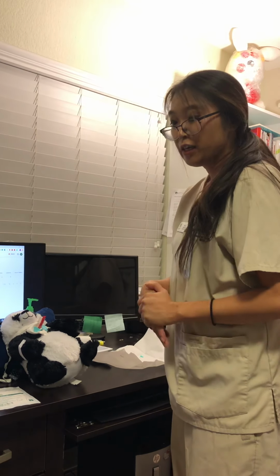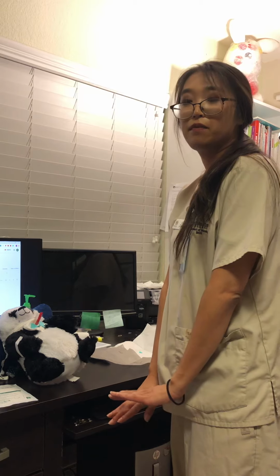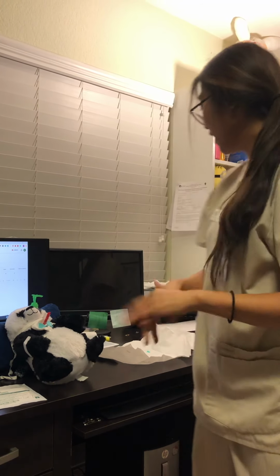And I would perform hand hygiene before I leave, but before that I would lower the bed to the level for safety of the patient. Here's your call light in case you need me, hand hygiene again, and then I'm done.